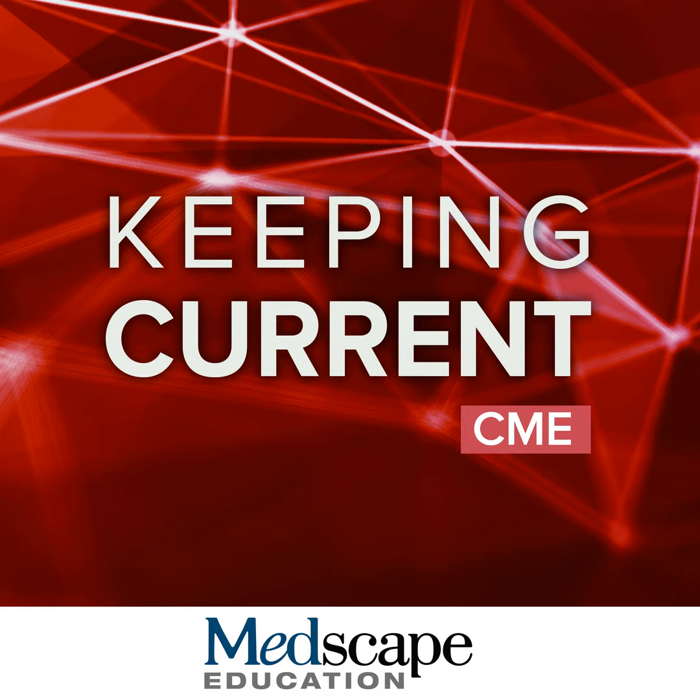So as you see, it's a big topic. We could probably speak the whole hour about that topic, but just to be succinct, I think that there are definitely advantages to 3T scanning because you have higher resolution. You can see in more detail the brain anatomy, the different brain structures. So that would be a reason to use 3T. On the other hand, we have a lot of patients who have metal in them or metallic devices in them. And from that perspective, it's safer to obtain 1.5T scans in those patients.